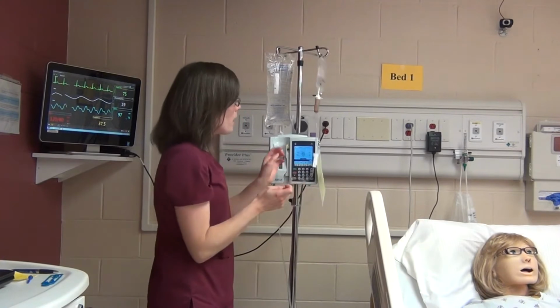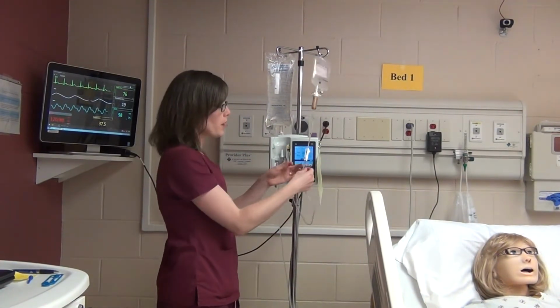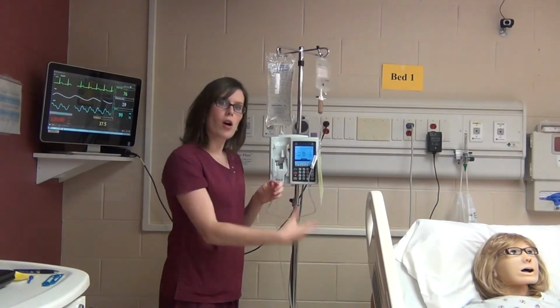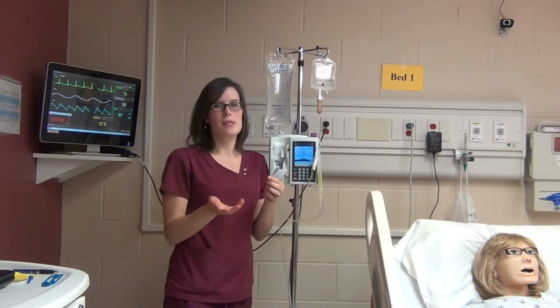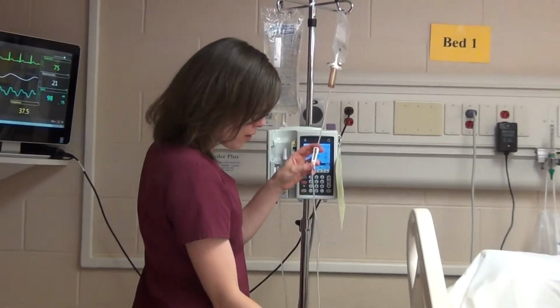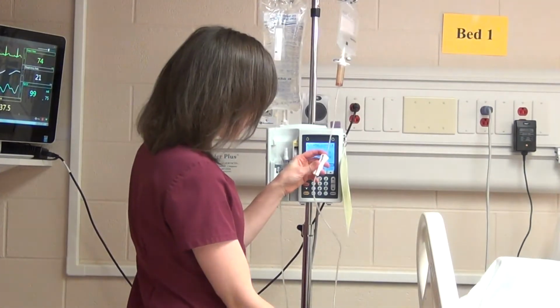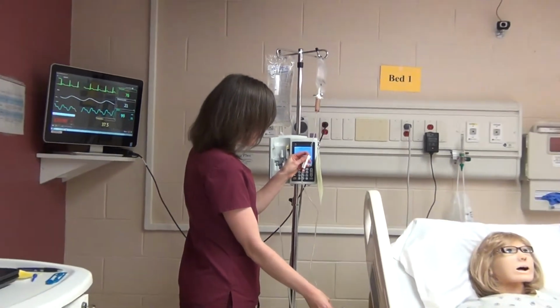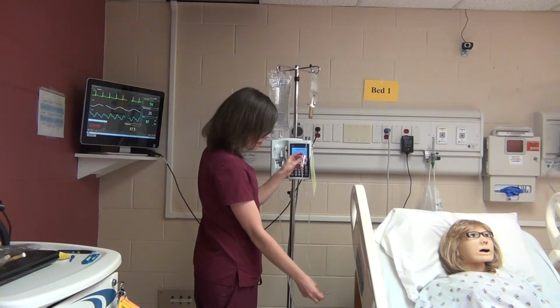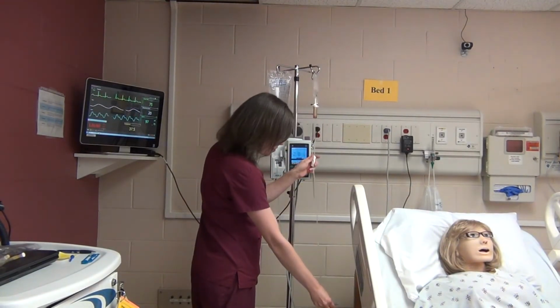Hang it up. And then a key with a medication is you don't want to undo the roller clamp and then all of the medication spills out, because that's wasted medication that the patient isn't getting. So you want to do it really slowly over your garbage, making sure that you keep this tip sterile. So I'm just going to release this slowly, and you'll see the medication kind of start to work its way down. There's just a little bit of air bubbles coming out now.